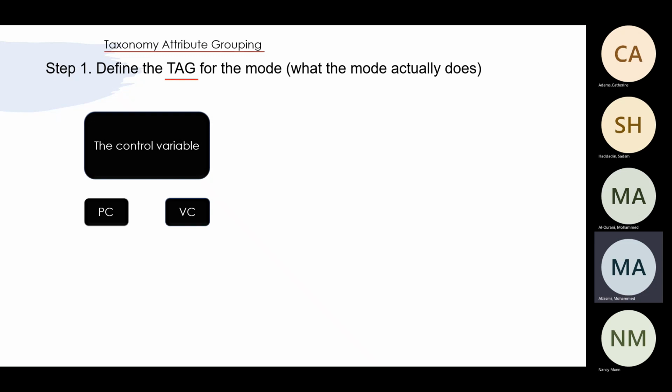But if I put a patient in pressure control, Mahmoud, what can the machine play with? I'm the one who will put the pressure control. The flow and the volume depend on what? That's right. Good. So that's the pressure. We have only two ways of control, pressure or volume. That's it. And then we have the breath sequence.